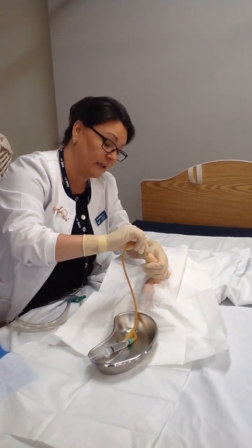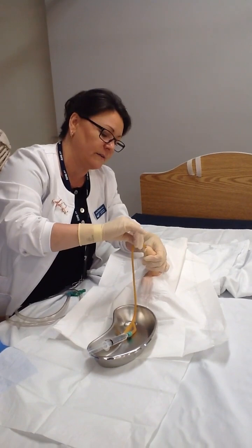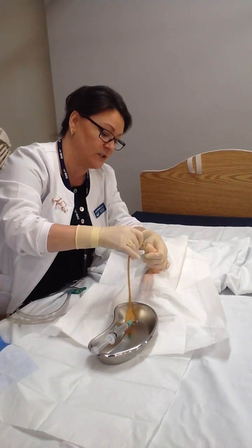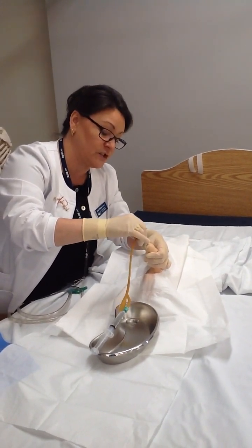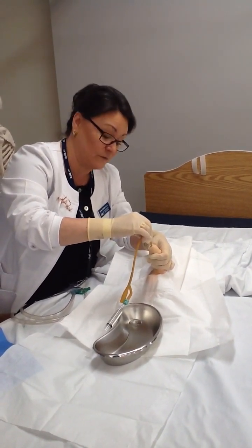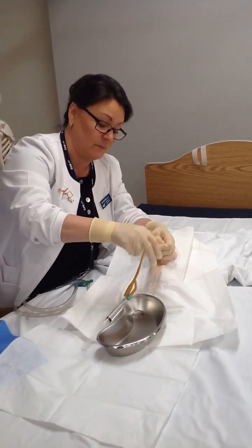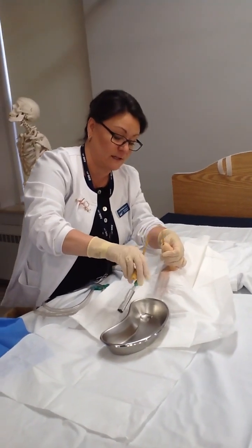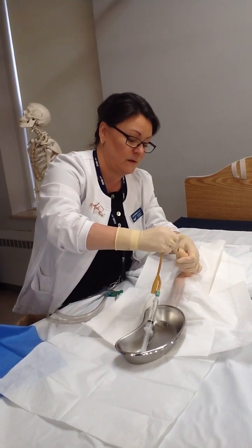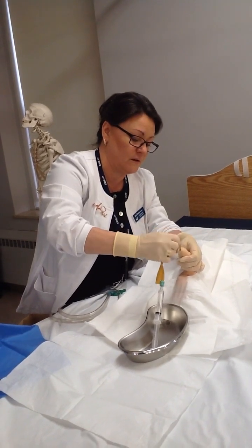So I push down a little, move my fingers back. Push down a little, move my fingers back, and so on until I get to about 17 to 20 centimeters. And I'm going to see urine. The catheter is going to want to bounce around a little bit. I'm still within my sterile field, and by now I have urine, so I'm going to insert it all the way to the bifurcation.